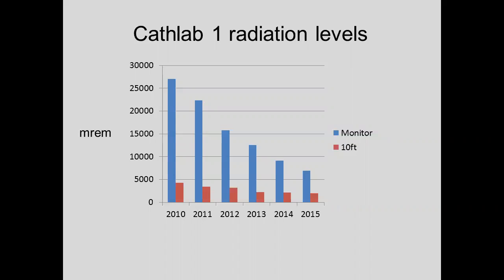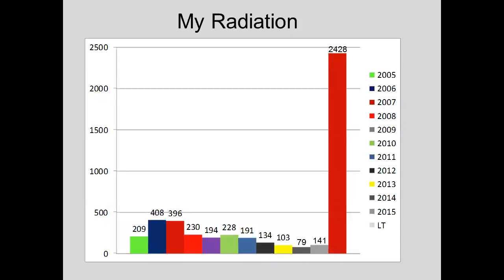Except for when a certain tech came in a couple of times and went, oh, why are we at 7.5? And then people, what, we're at 7.5? And they got all upset. But when I did it without telling them in my blind study, no one ever noticed. And when it came up and said, well, Chris changed it, I said, oh, did I? Oops. So I did a blind study, no one really noticed, going down to 7.5. Once again, my lifetime radiation so far is 2,000 millirem, sorry, 2.5 rem. I'm not too worried.